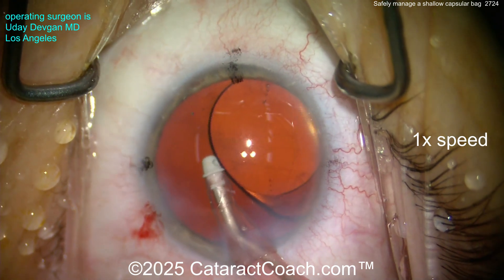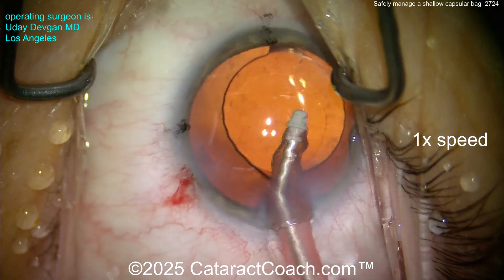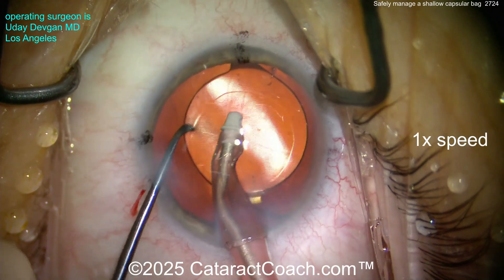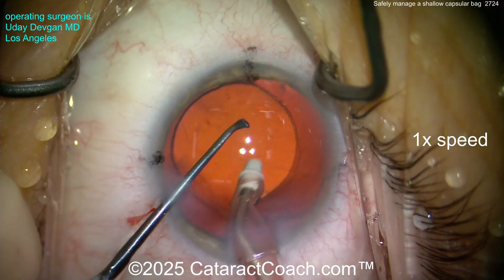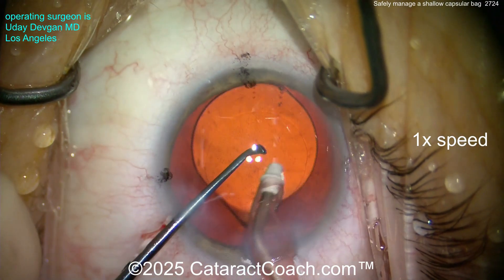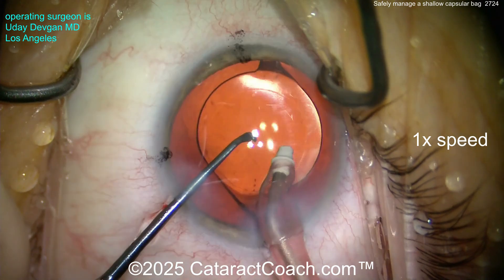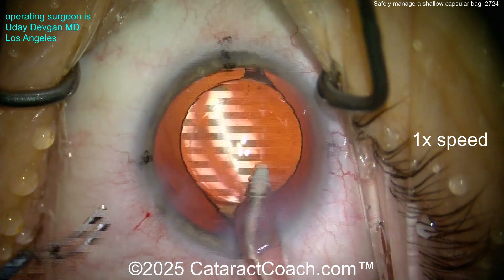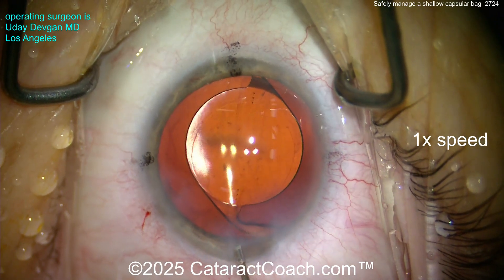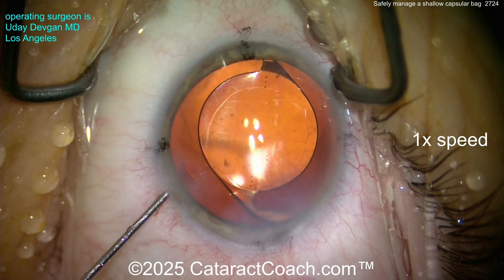Back at normal speed — getting the lens in good position, rotating it a little if needed. Now if you still have a lot of aqueous or BSS in Berger's space in front of the anterior hyaloid face in the post-op period, remember the lens optic may sit more anterior. That means a little myopic shift on post-op day one — but it's okay. Give it time, see the patient back in about a week. The fluid will equilibrate and the patient will be at the refractive target you planned.